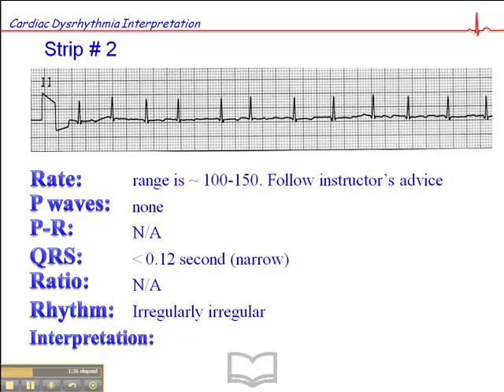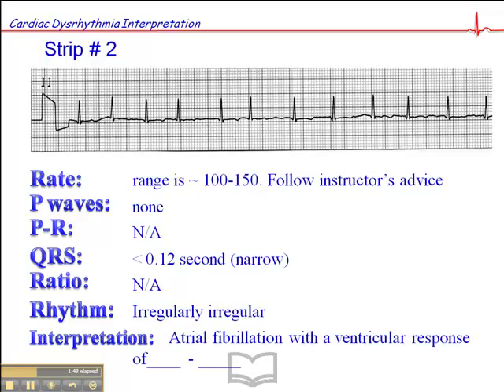Here's the key finding. This rhythm is irregularly irregular. And whenever you have an irregularly irregular rhythm without any discernible P waves, the interpretation is pretty straightforward — this is atrial fibrillation.